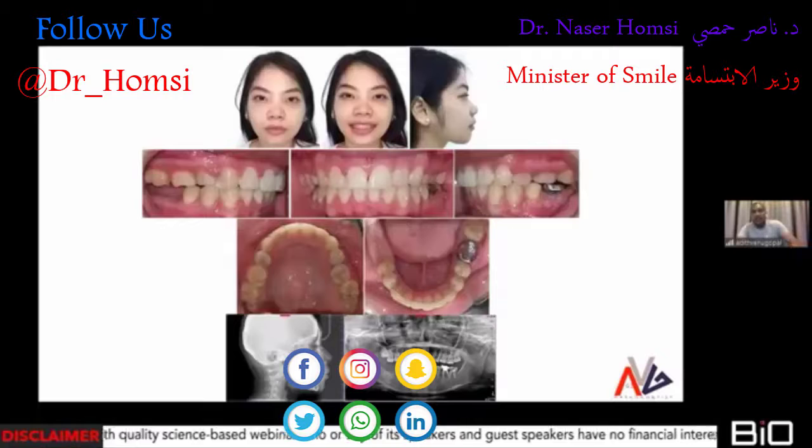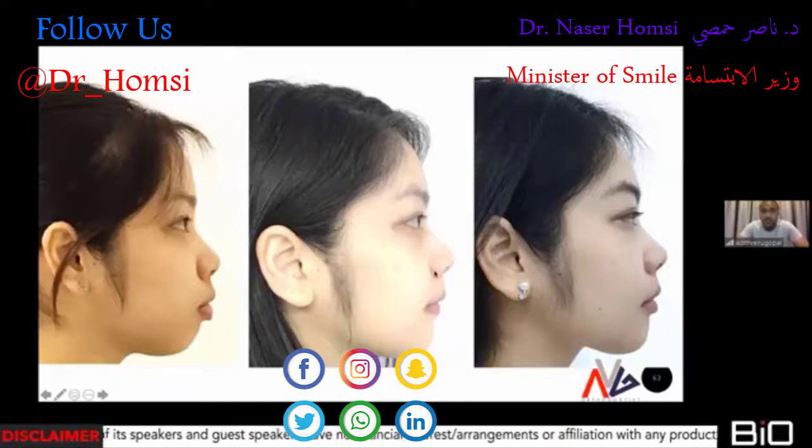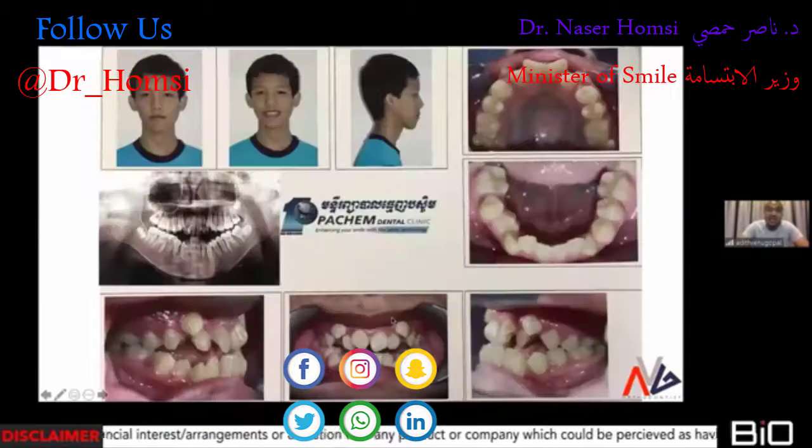And you can see over here that I was able to distalize the mandibular dentition quite a bit. You can see the change in the profile, that's huge. And you can see the amount of distalization that I achieved on the lower molar, which is more than about 6 millimeters, which is unlike the stereotypic evidence, which claims that you could just distalize for just about 3 millimeters. There are some exceptions in which it is possible. It depends on the anatomy behind the second molar.